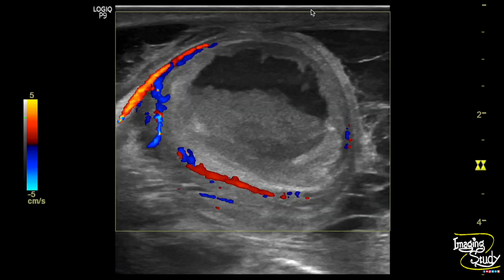Here is the thick-walled complex area with thick sediments. Color Doppler shows peripheral flow, indicating it as an abscess with adjacent inflammatory collection. The overall skin was also thickened due to the inflammatory process.